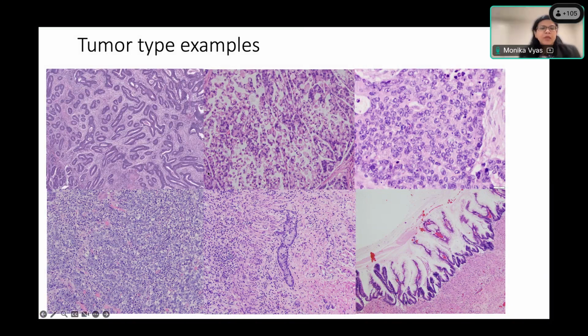Okay. So after neuroendocrine, we went to the lower left image, and that's just a poorly differentiated morphology of carcinoma. You have many differentials there, right? So it could just be poorly differentiated adenocarcinoma, it could be neuroendocrine, it could be squamous cell. So you would do appropriate immunohistochemical stains or look for histologic clues to help you determine if this could be an associated subtype.